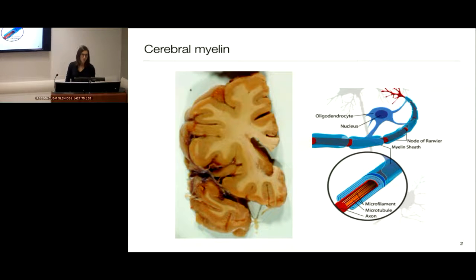So in the field of brain imaging, there's actually a lot of people who focus on imaging myelin content, and I would say that one of the reasons for this is that it's one of the main sources of MR contrast, and it really does affect most of the contrast mechanisms that we use almost every day in MR imaging of the brain.